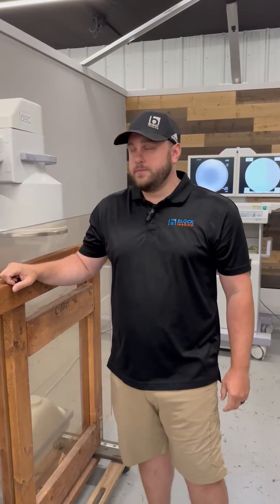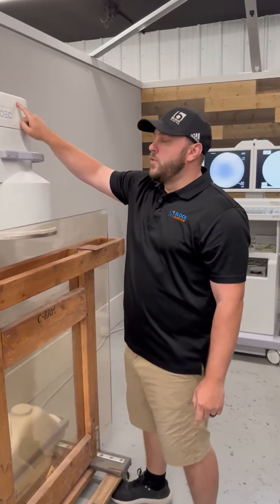Hey guys, Matt with Block Imaging here. Today I'm going to be showing you how to adjust your ABS on your OEC 9800. The first thing you want to do is remove your camera cover.